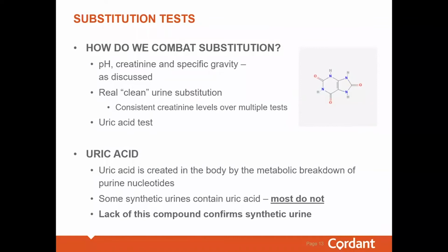One thing I like to tell people when you are combating substitution of another person's authentic clean urine is to look for multiple tests in a row with the same creatinine. Often people will get one sample, dilute it a little, and use that same sample or lot multiple times in a row. If you see multiple samples with the same creatinine, you should be suspicious. It is physiologically impossible to reproduce the same creatinine level multiple times in a row.